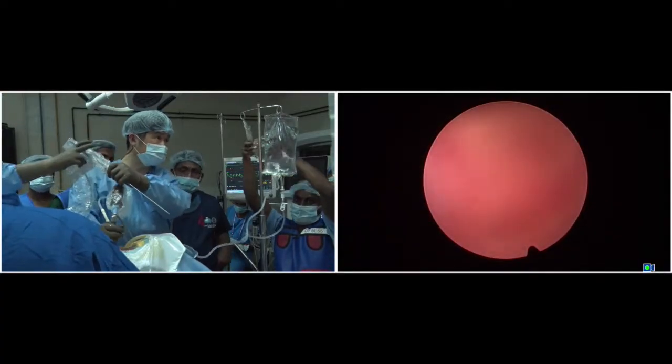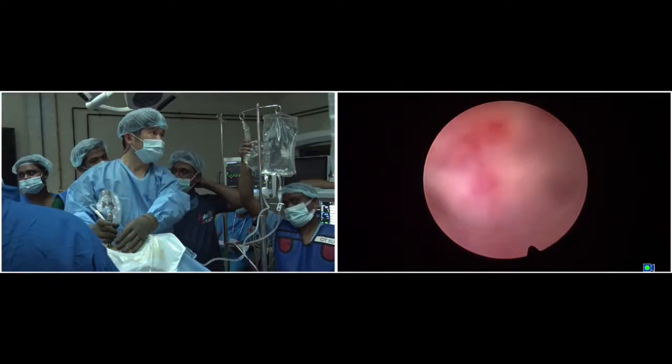Here, have a pedicle here. Okay. Okay, RF.